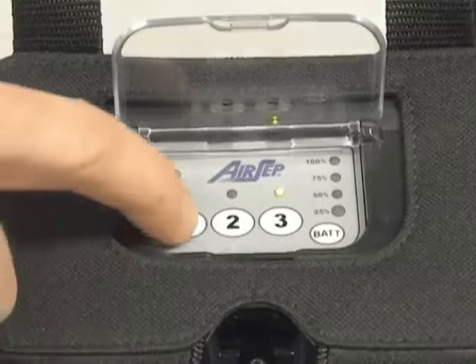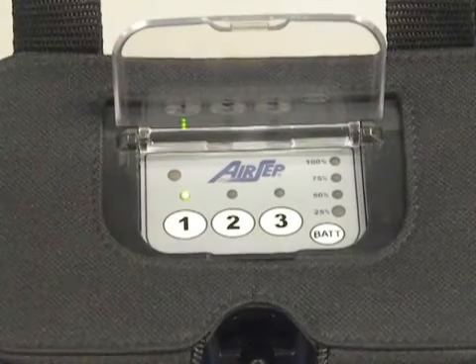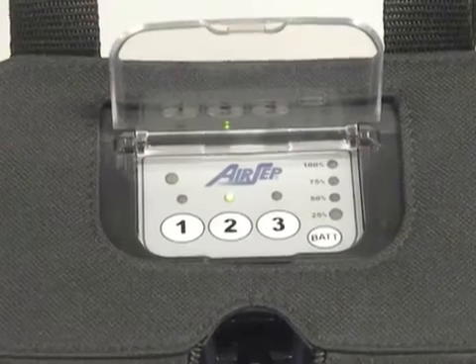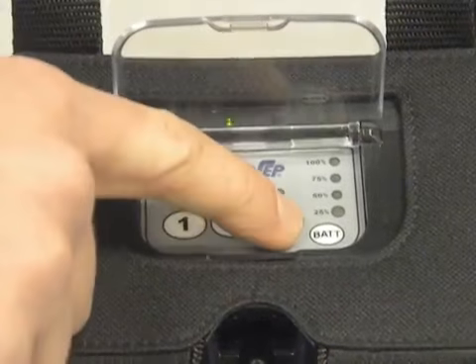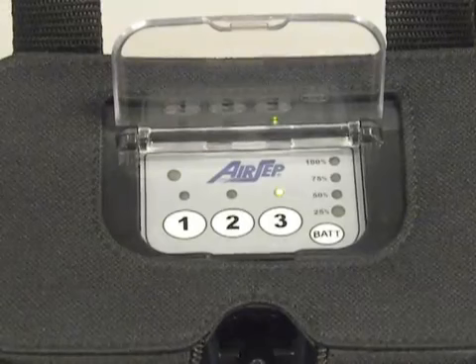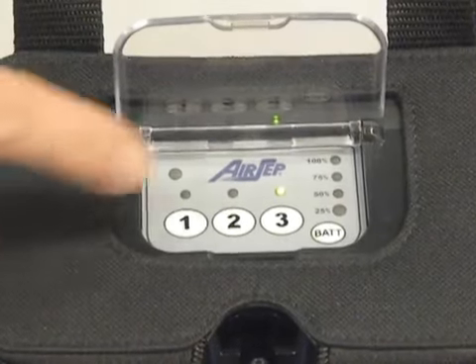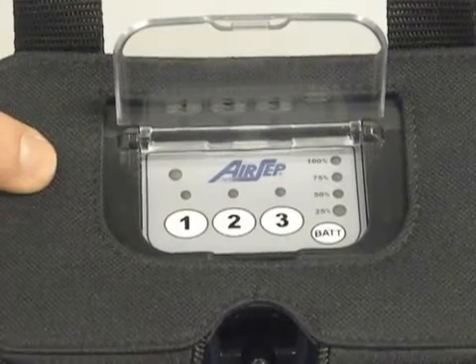To go to other modes, simply press 1 for pulse setting of 1 and it will start auto-pulsing at 1, or press 2 and it will auto-pulse at 2. And you can go back to 3. To exit test mode, you will just need to press whichever button has the light lit and it will shut the unit off.